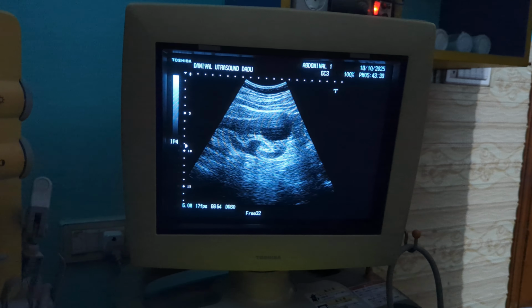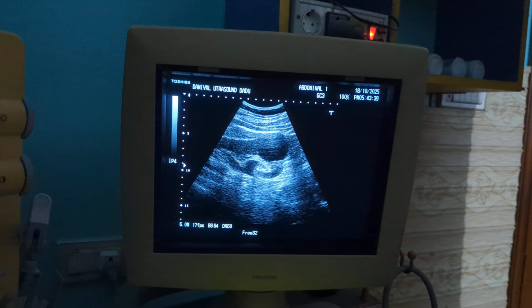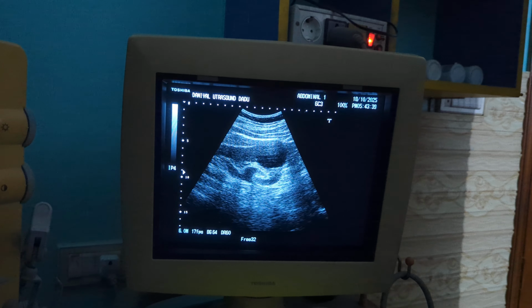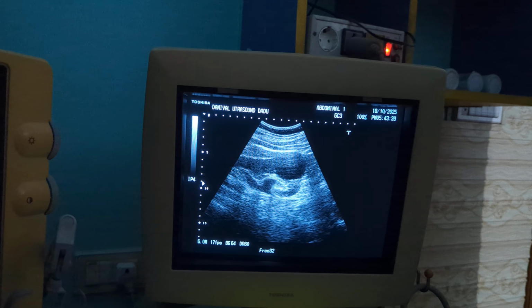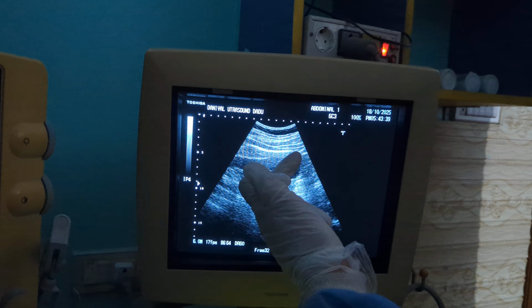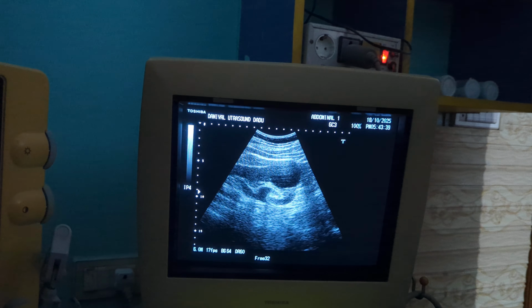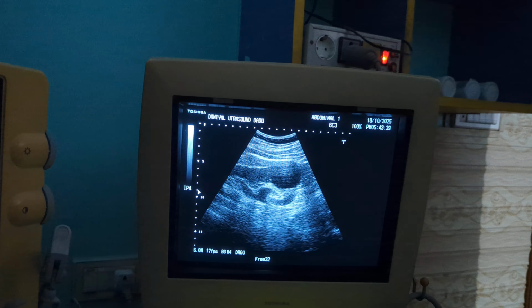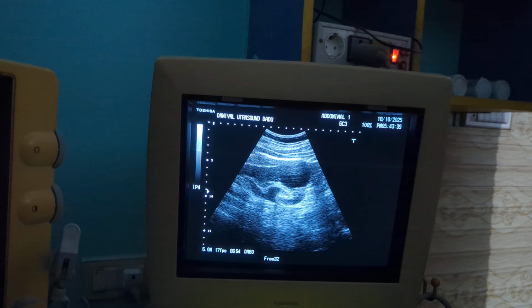In most of the cases, it is located within the renal cortex like this, or in the parenchyma, and often it's at the periphery or exophytic, out of the surface like this, and it's located in the cortex as well. Now the hydronephrosis shows branching, irregular or cauliflower-like anechoic spaces. The walls are formed by a thin renal parenchyma.